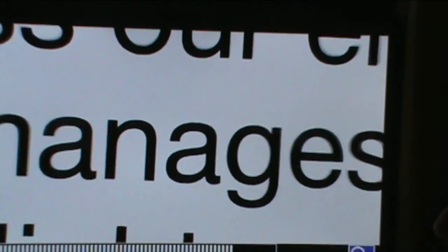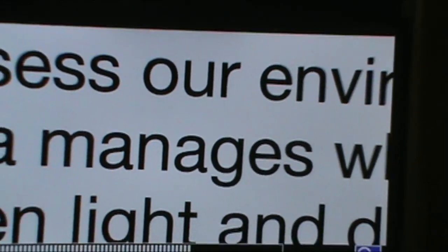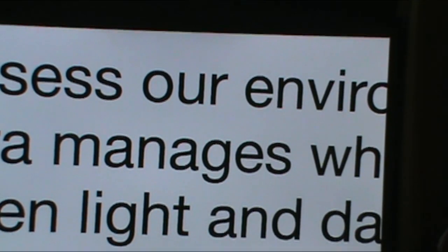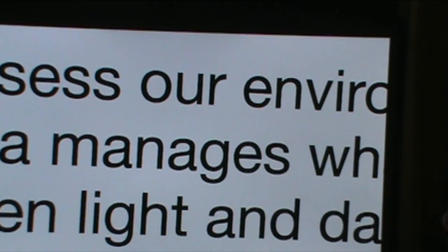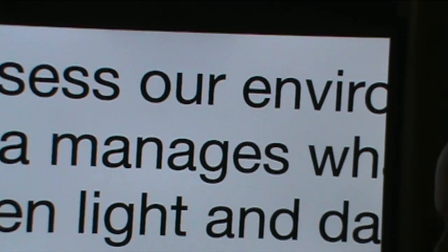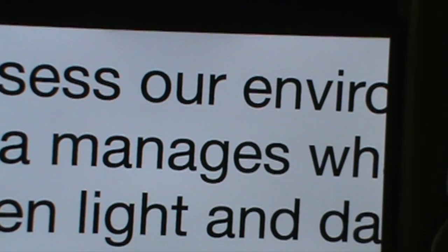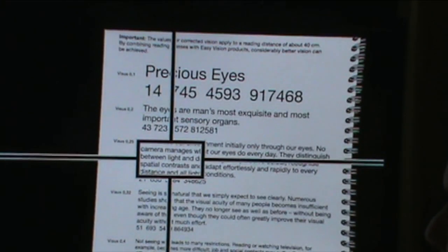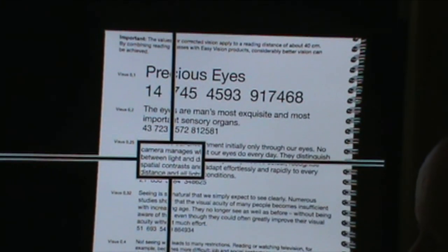Now, when we're reading print this large, or in large format, if you will, sometimes we can get lost on the system. This machine has a locator function, and if we just press our locator, which is this little square here, you won't see it on camera because we're looking at the screen, but if you notice your center dial on the XY table, to the right of that center dial, there's a square. I'm going to press the square. It brings the print down in size.